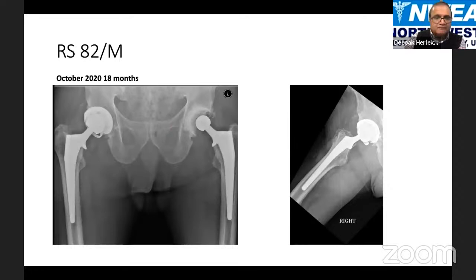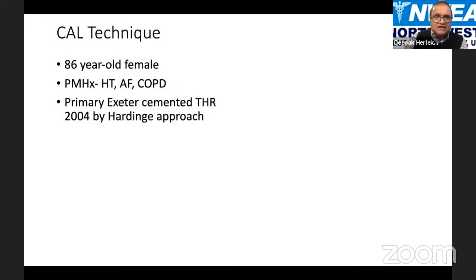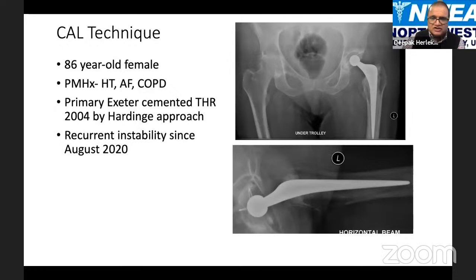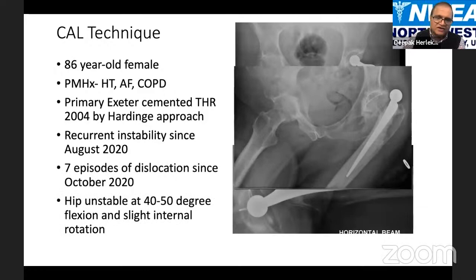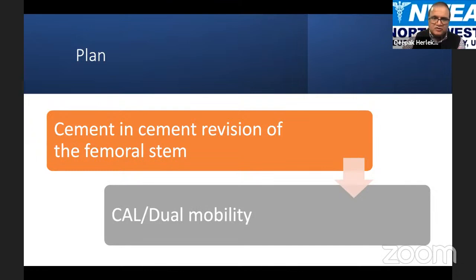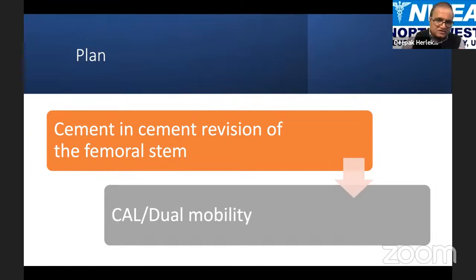Now a technique demonstration: an 86-year-old lady with multiple comorbidities had a primary Exeter total replacement in 2004 via Hardinge approach. She developed instability since August 2020 with multiple dislocations, with the hip unstable at 40-50 degrees of flexion and slight internal rotation. Revision was planned: femoral stem cement-in-cement revision, and for the acetabulum, options were constrained liner or dual mobility. Using a posterior approach, when the hip was exposed, the abductors were found to be almost completely detached.